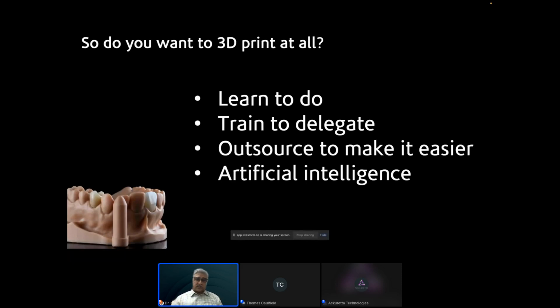I'm going to suggest, though, that your need for all of these things is going to become less and less because artificial intelligence is certainly taking over digital workflows. It's possible today to have, say, 3Shape Automate design a crown for you completely using AI. There are AI splints available with Medit apps, for instance. And there is AI available for orthodontic aligners with a company called Neural Hive.